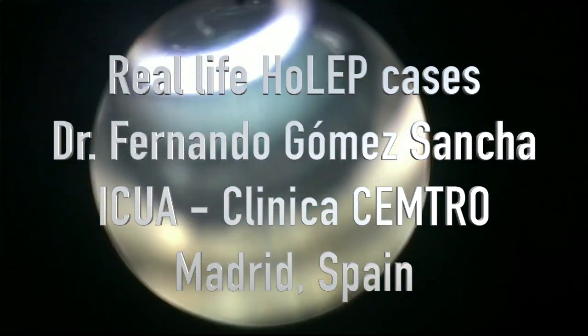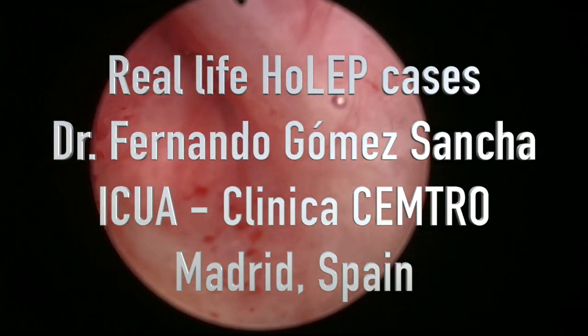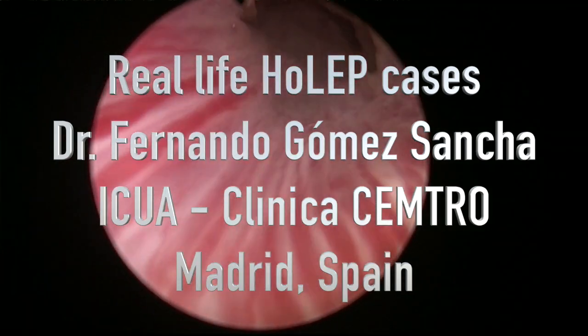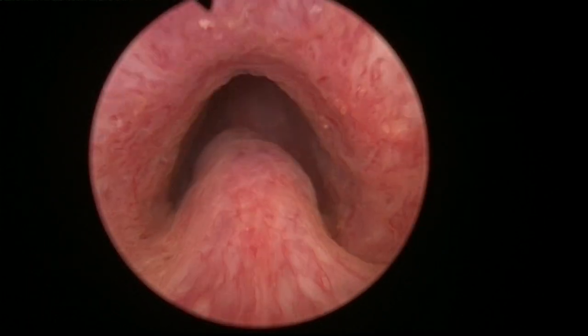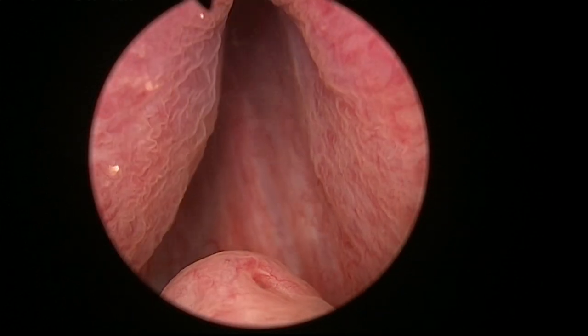Okay, so this is the last case of today. I think the meatus is a little bit tight, but no, it's good. Yeah. We have big urethras in Spain, maybe. So this is the sphincter edge, more or less, huh?